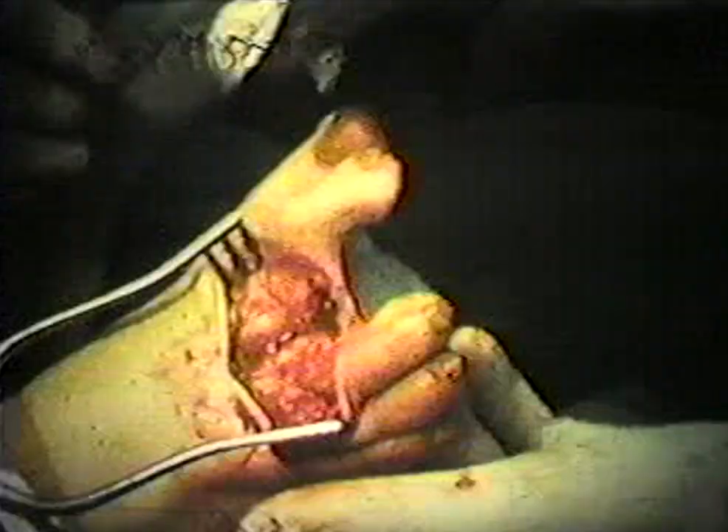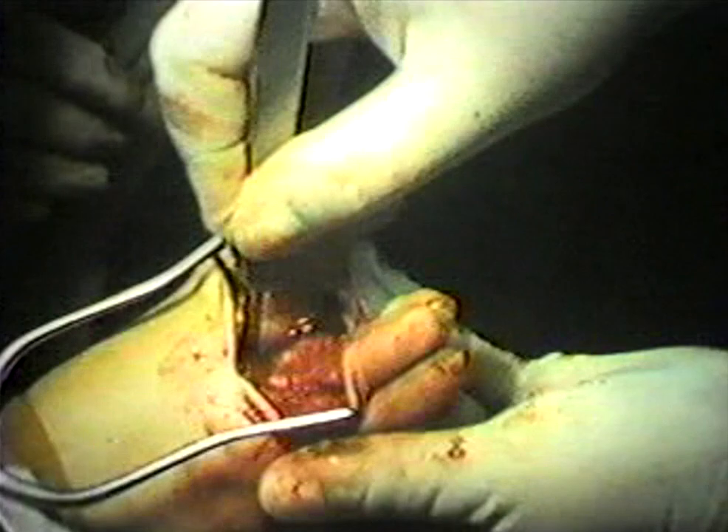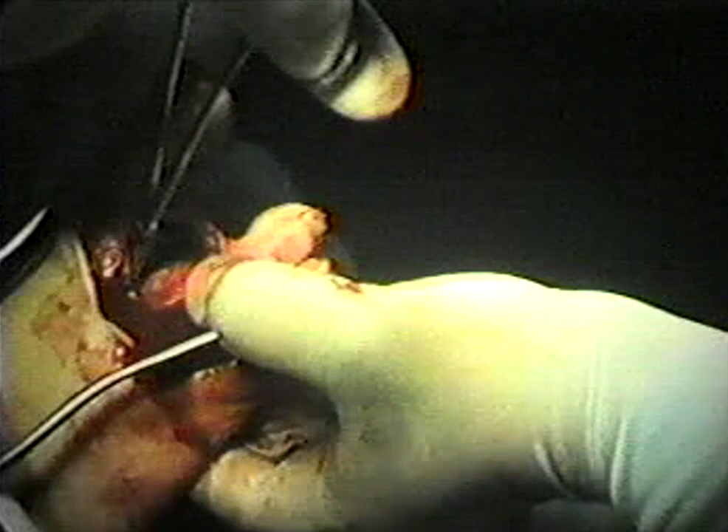We are now ready to do the neurotripsy. We take our number 15 blade and go between the metatarsal shafts until we reach the plantar aponeurosis where the medial plantar nerve lies at its bifurcation. The patient will feel this and we will know we are in the right area. We then crush the nerve at its bifurcation with a large hemostat. There is approximately 5 to 10 seconds of pain during this procedure, but it is important that we know the location of the nerve so that we have the patient let us know at this time. That is why we do it under local anesthesia. As you can see, the spasm is completely broken, which is what we will see if the nerve is crushed properly.